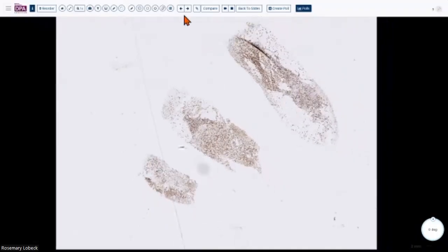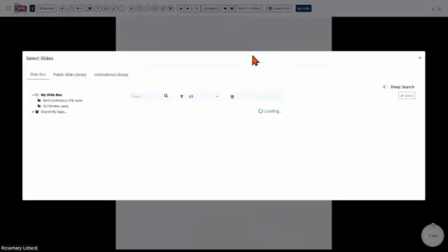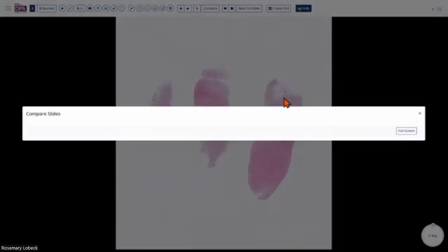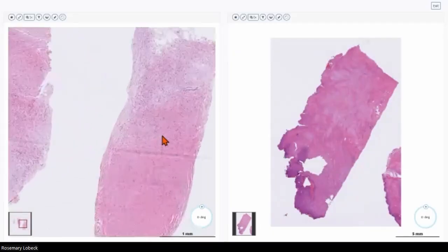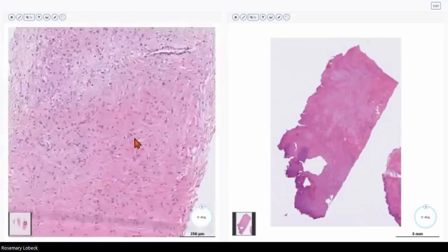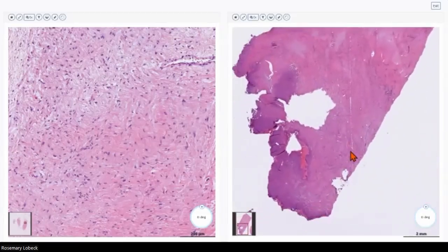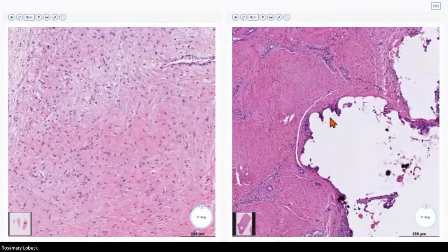So I just wanted to go back a little bit to the previous slide and see if I can compare it with another case I have on file over here. So let's try this. On the left here, this is the low-grade fibromyxoid sarcoma I just showed you. Let's zoom in and keep it there. And then on the right side, this is a lesion that's been excised from a knee joint. This is a patient who had hardware failure, and then the hardware material leaks out and forms a fibrotic scar reaction, right? And here you can see evidence of that foreign body type giant cell reaction.